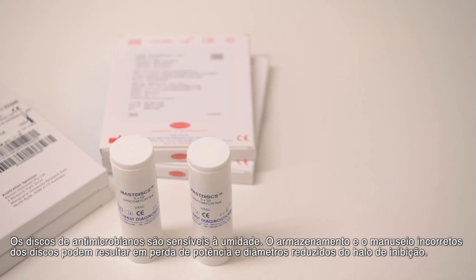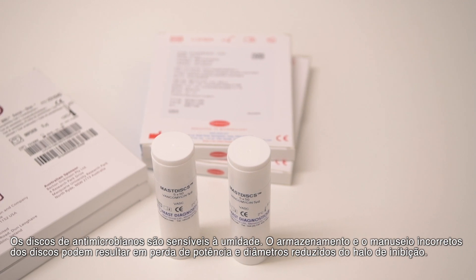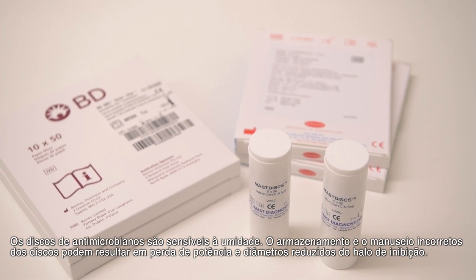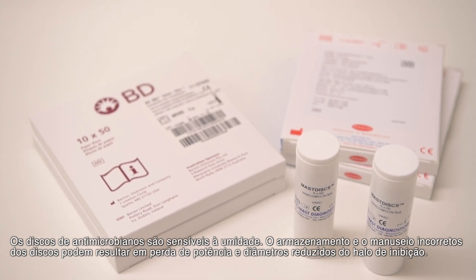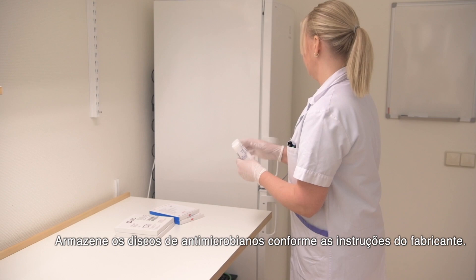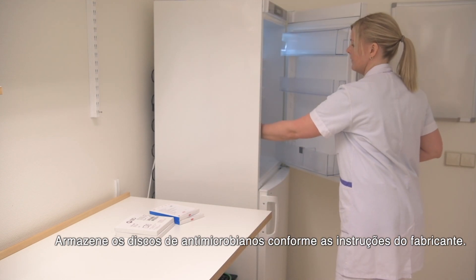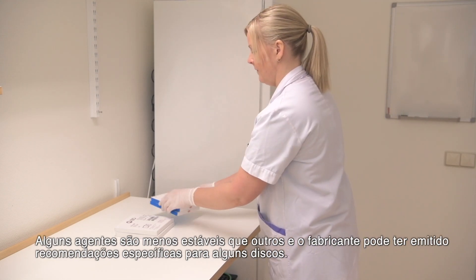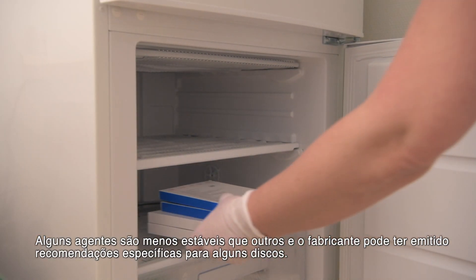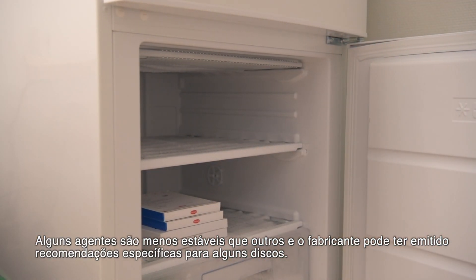Antimicrobial paper discs are sensitive to moisture. Incorrect storage and handling of discs may result in loss of potency and reduced inhibition zone diameters. Store antimicrobial discs as instructed by the manufacturer. Some agents are less stable than others and the manufacturer may have issued specific recommendations for some discs.